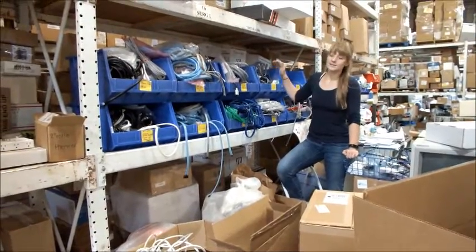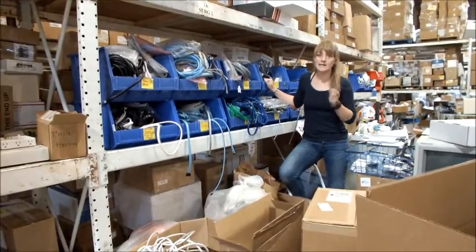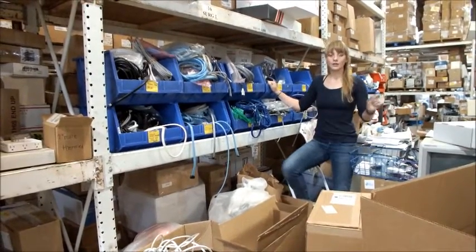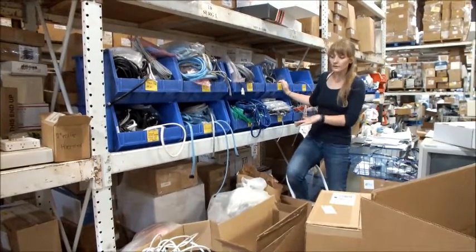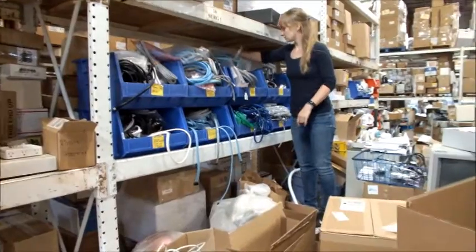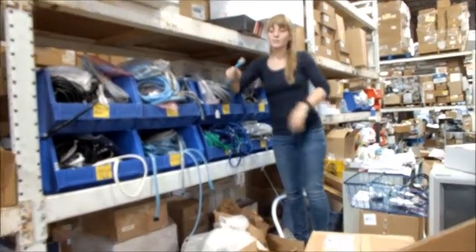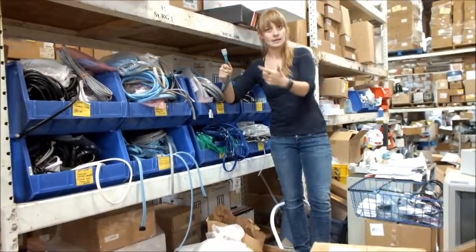Blood pressure cuff tubing is organized back here based on the kind of attachment to the device that the tubing has. You're going to want to check on your device what kind of tubing you need and then look over here for that kind of tubing. For instance, this kind of tubing will connect to the small blue blood pressure machine that we're testing in the other room.